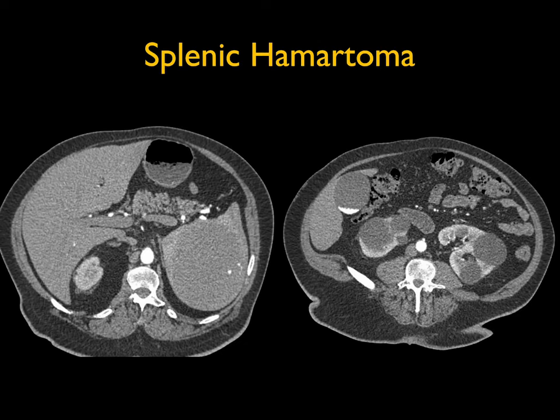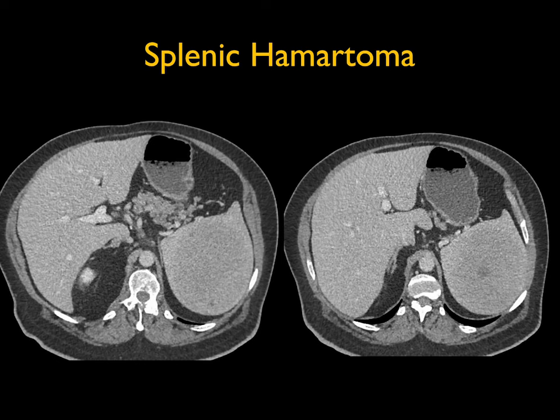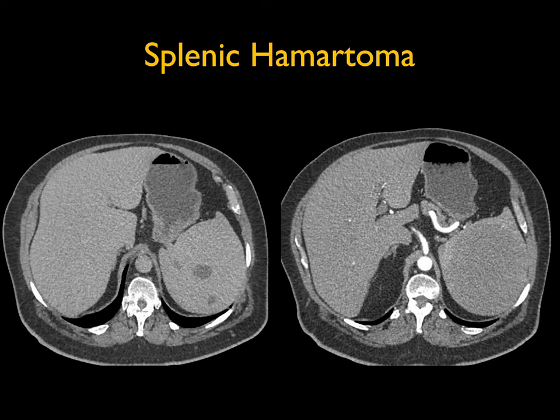In case seven, we see a mass in the spleen. The differential includes hemangioma, cyst, metastasis, and lymphoma. But what you see is a well-defined mass that creates bulging of the spleen. When I see that kind of appearance of a fairly homogeneous lesion, I have to think about a hamartoma. Hamartomas are benign — they're leave-alone lesions with no malignant potential and no increased incidence of bleeding. You can't really biopsy them, so making the diagnosis of hamartoma is important.